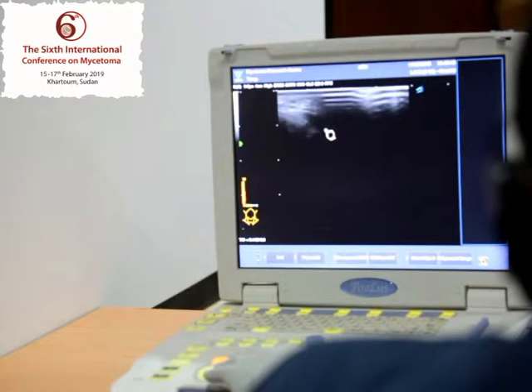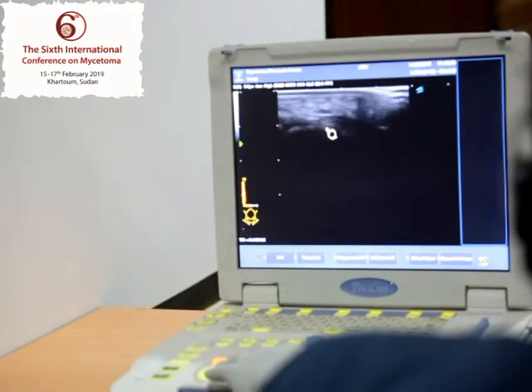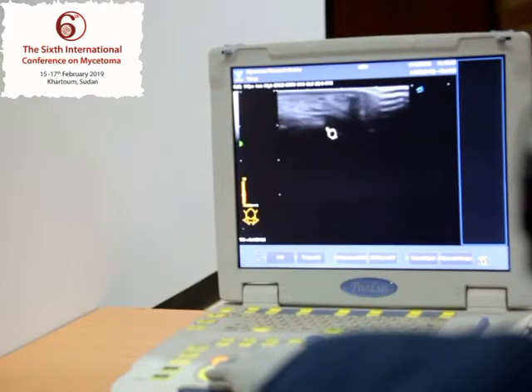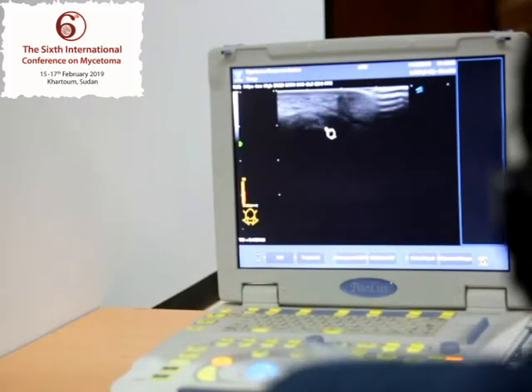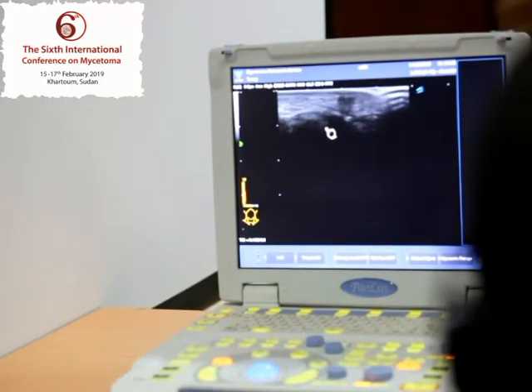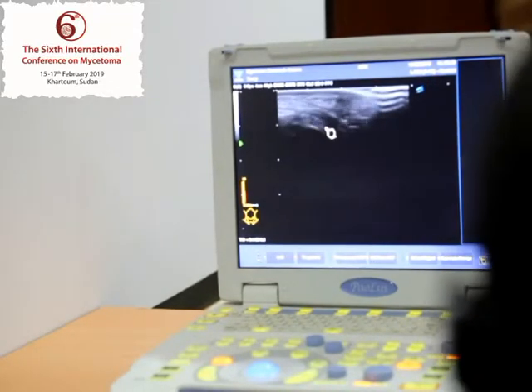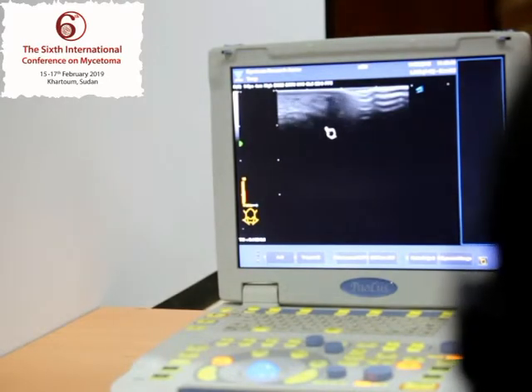We cannot see any foreign body at the site of the lesion, because sometimes we take up foreign bodies. So this is the first case. It's a straightforward case of mycetoma, an early disease, a single cavity, which is located superficially.